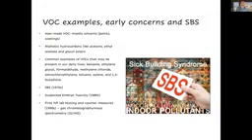Fortunately, those nature derived VOCs have a very high partition coefficient. Dr. Warrilow will come back to that later. And so they don't dissolve very well in aqueous solutions. So they don't dissolve well in culture medium, but they could dissolve in oil.